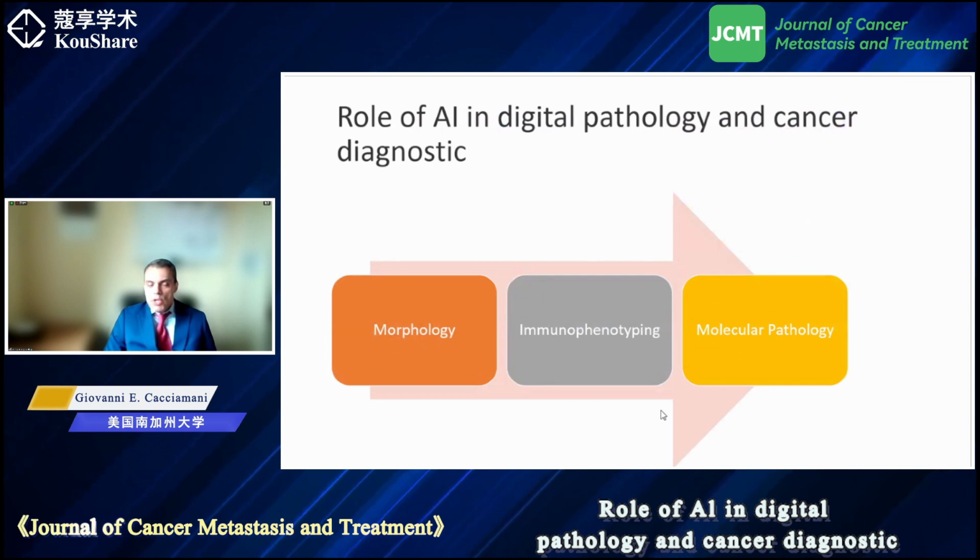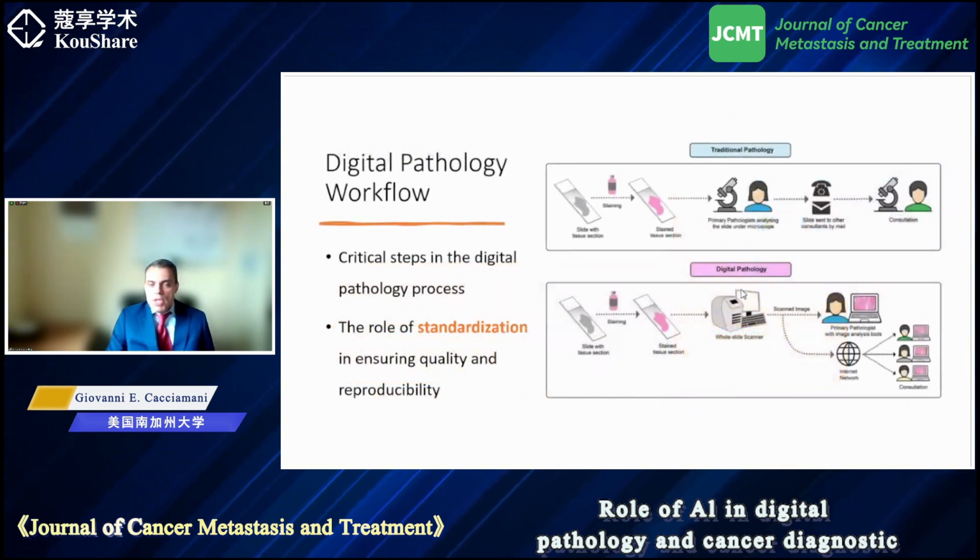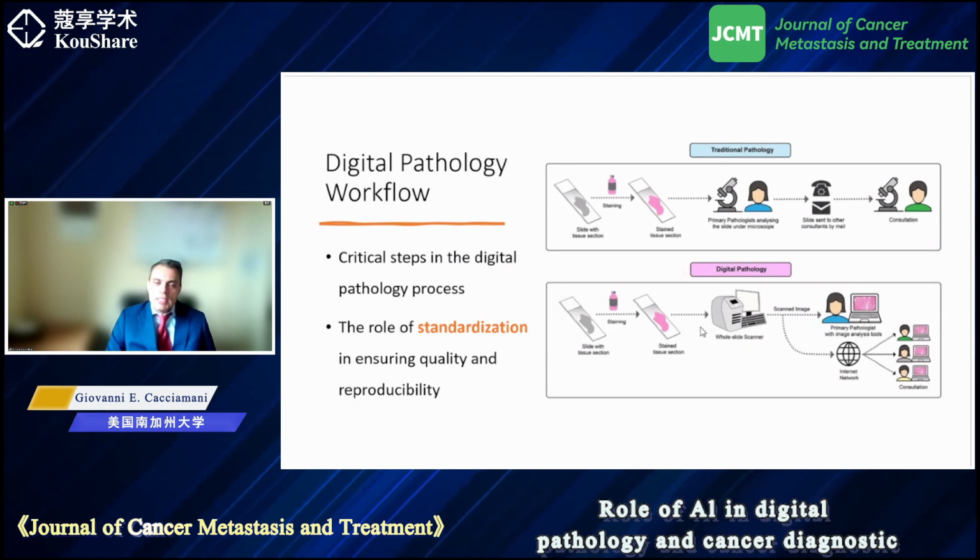But if we consider the patient journey and doctor journey throughout pathology, from morphology to immunophenotyping to molecular pathology, where do we place digital pathology and algorithms? Well, if we compare the standard approach in which the tissue is processed, goes to slide, and the pathologist will perform the examination and reporting, with digital pathology, we just add a very early element.